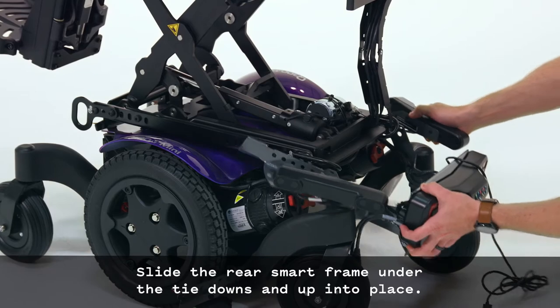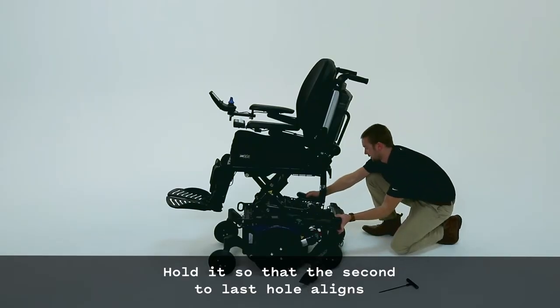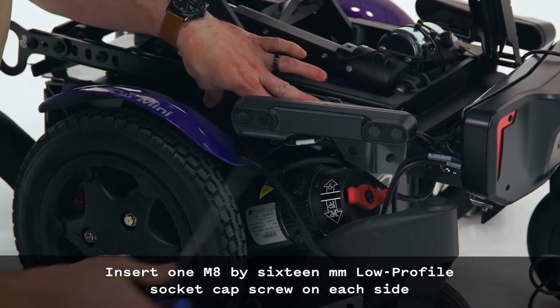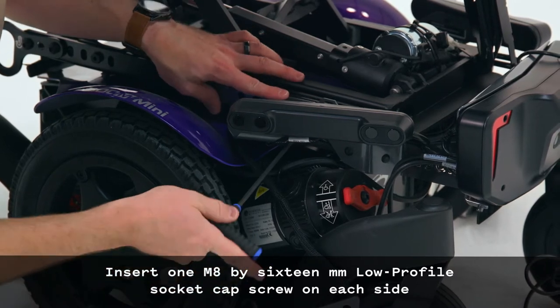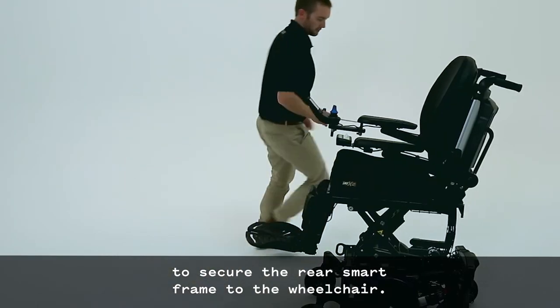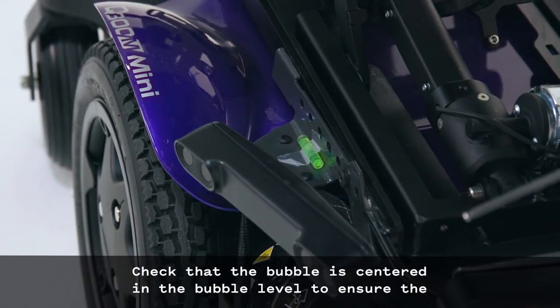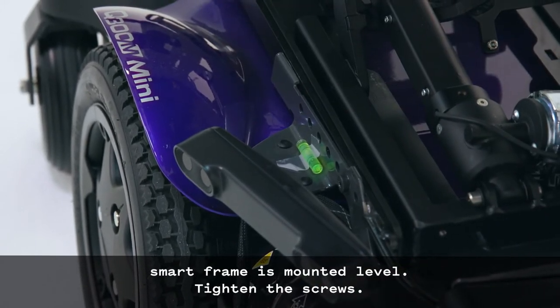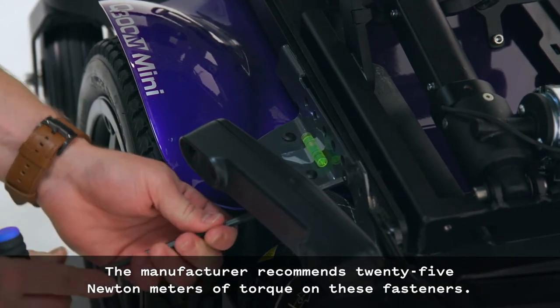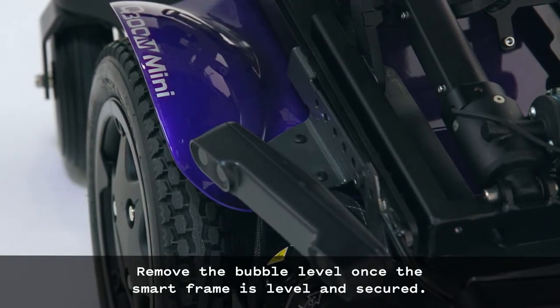Slide the rear smart frame under the tie downs and up into place. Hold it so that the second-to-last hole aligns with the threaded hole that attaches the seating assembly to the chair. Insert one M8 by 16mm low-profile socket cap screw on each side to secure the rear smart frame to the wheelchair. Check that the bubble is centered in the bubble level to ensure the smart frame is mounted level, then tighten the screws. The manufacturer recommends 25 Nm of torque on these fasteners. Remove the bubble level once the smart frame is level and secured.